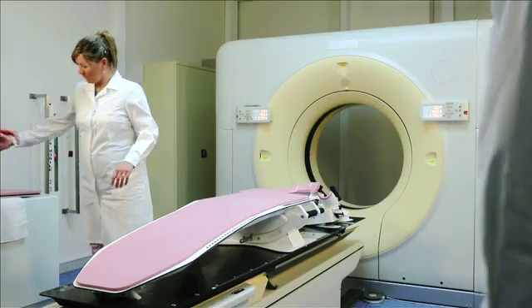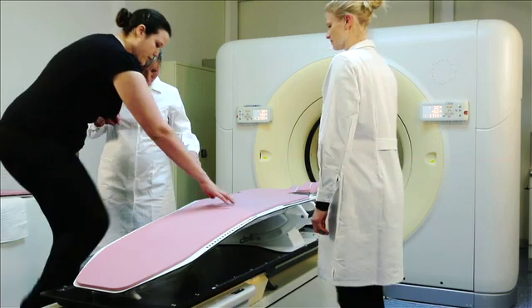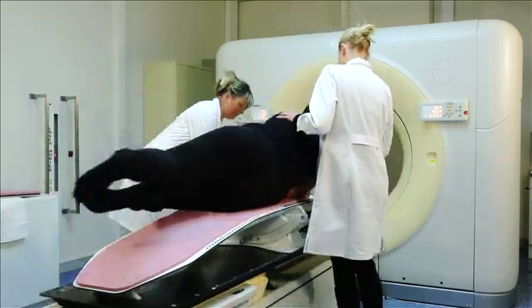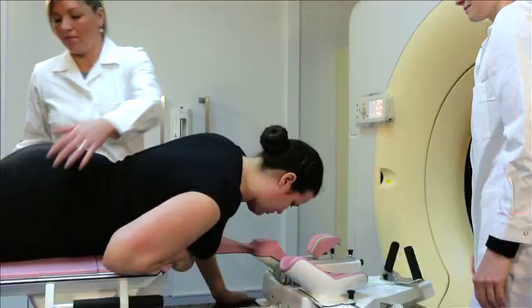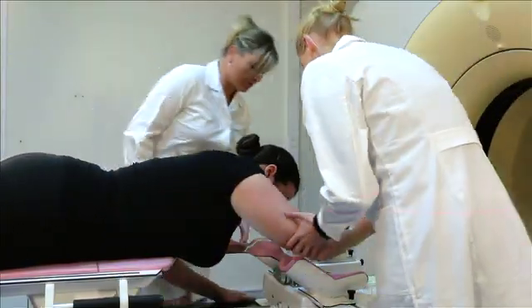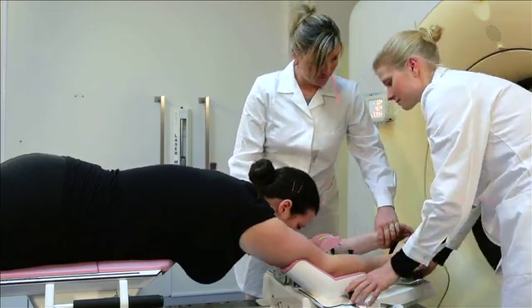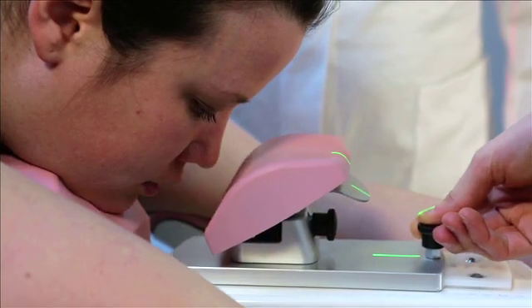Assist the patient to find the correct and comfortable position on the prone breast system. Position the chin and ipsilateral breast first, as the cutout and chin support are in a fixed position. Then adjust the movable supports in order to obtain the most comfortable position for the patient.